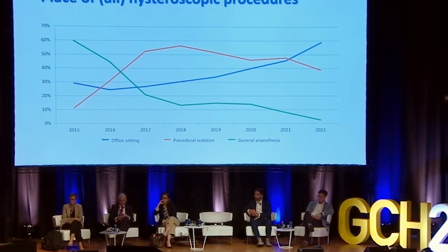At the end of 2022, we performed only 3% of all procedures in the OR, and they are mainly due to logistic reasons. But more interestingly and more promising, more than half of our procedures were now done in the office setting without any anesthesia or only pericervical anesthesia.